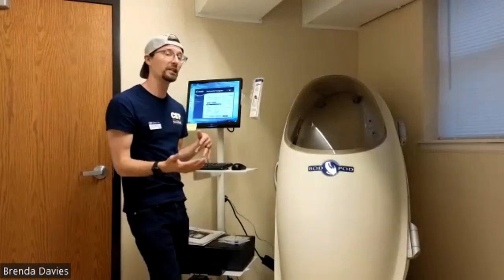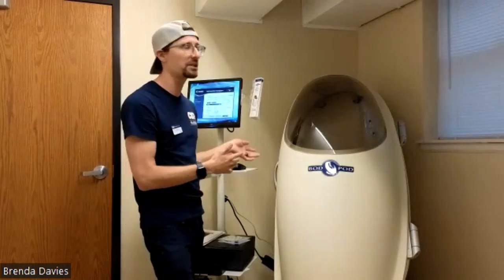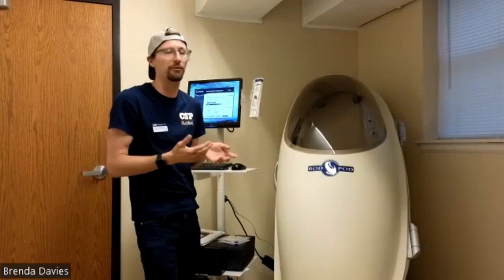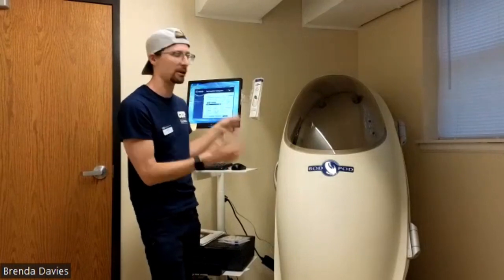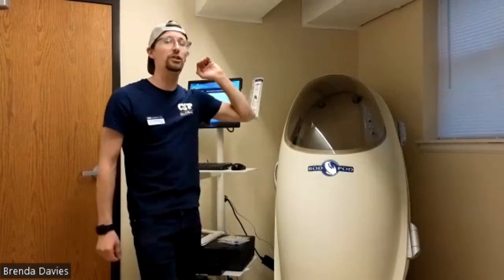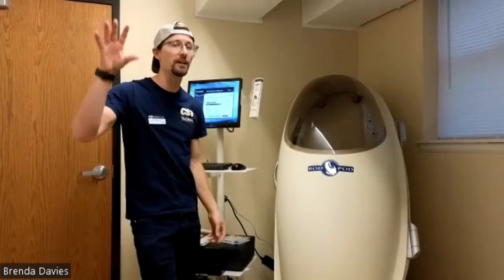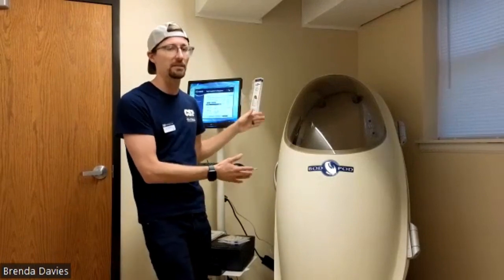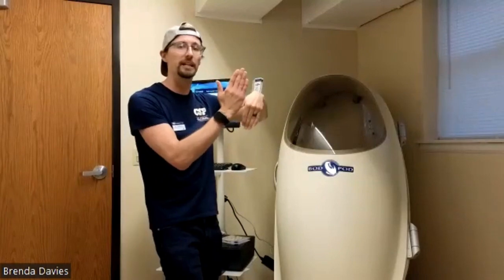Some variables are going to impact the Bod Pod's accuracy. If it is raining outside, that's a problem. Well, it has been a problem before. It can impact the calibration. And again, this is based off of the Archimedes principle. If you have changes in temperature or changes in pressure, then its accuracy is going to be impacted, because what we're looking at is pressure and volume being inversely related between two different areas.